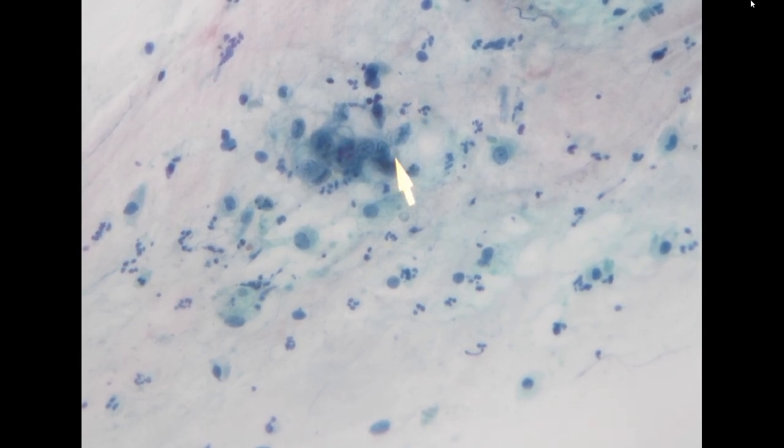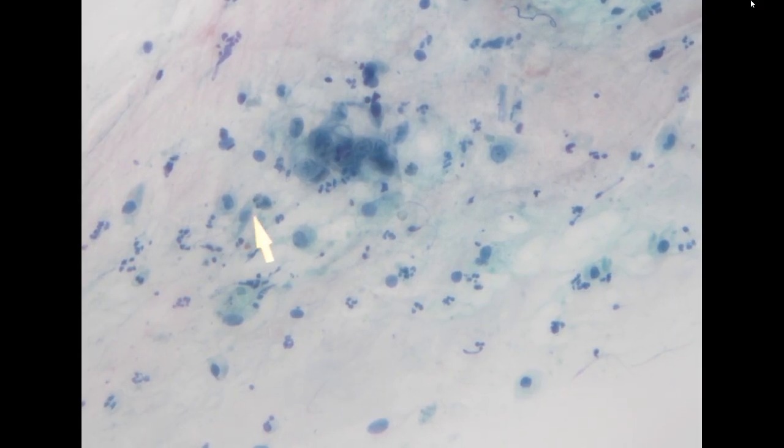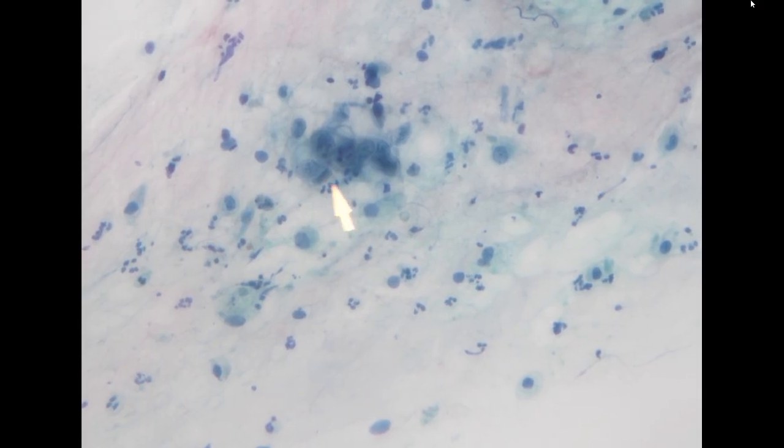So in this setting, usually the endometrial element would be markedly degenerated. So it is not easy to appreciate the morphology of the cell because it is already degenerated. And in the background, usually there is more necrotic debris as well as some inflammatory cells.